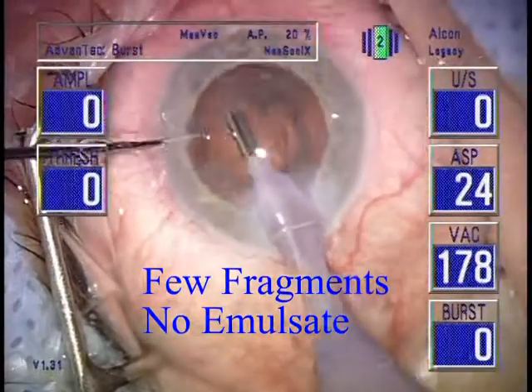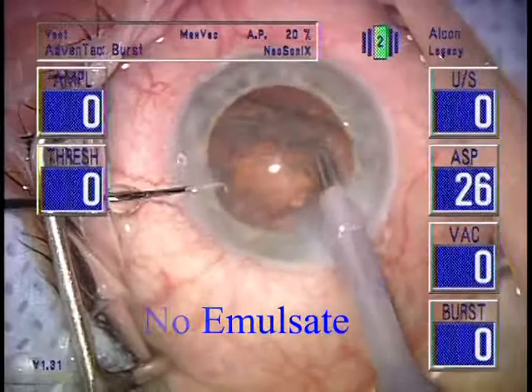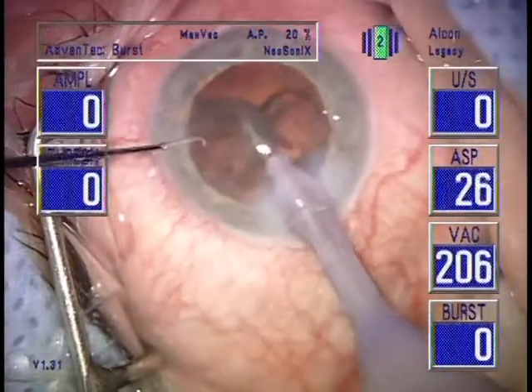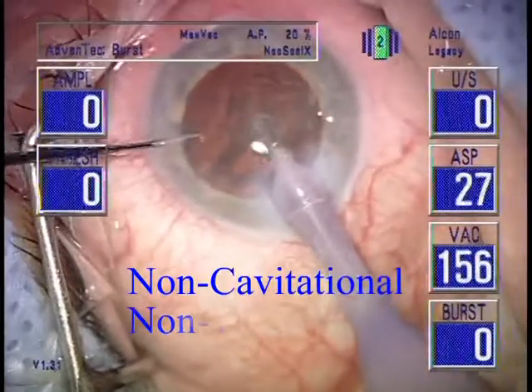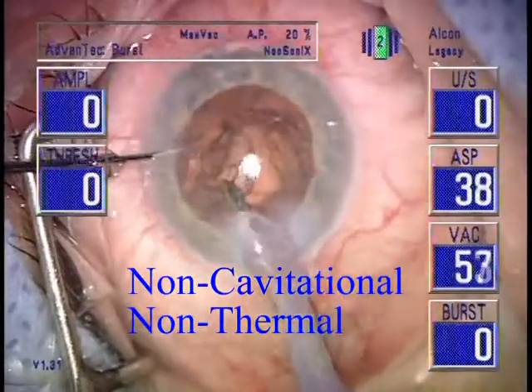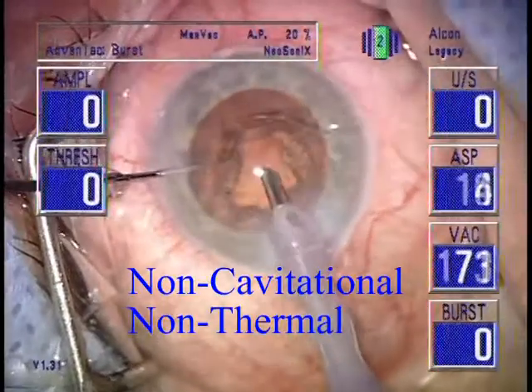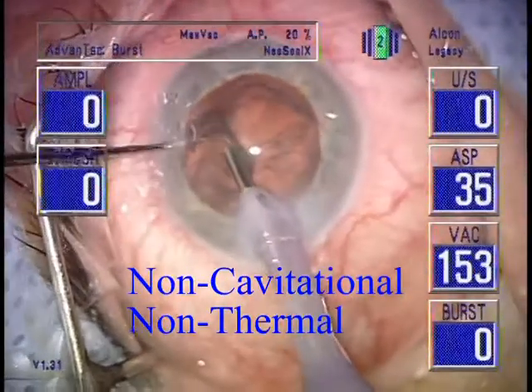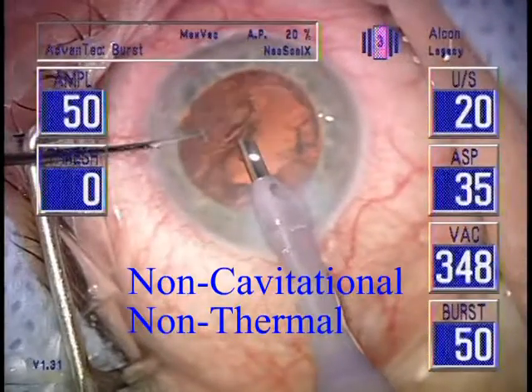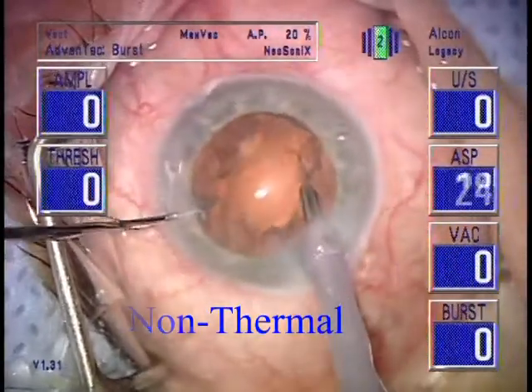Very short, surgeon-selected individual applications of power are much safer than traditional continuous mode, pulse mode, or burst mode. The effect is limited, localized, and non-thermal. The power bump can be longitudinal and/or oscillatory, as with the Alcon Neosonic machine.